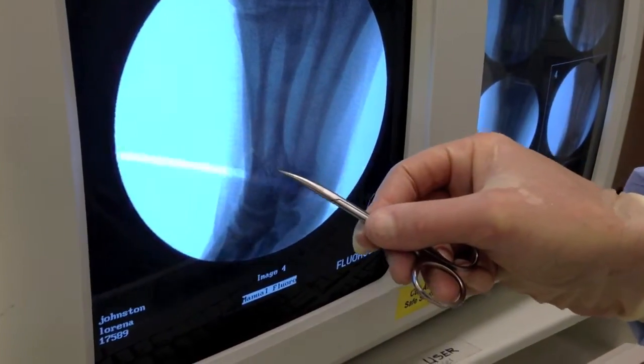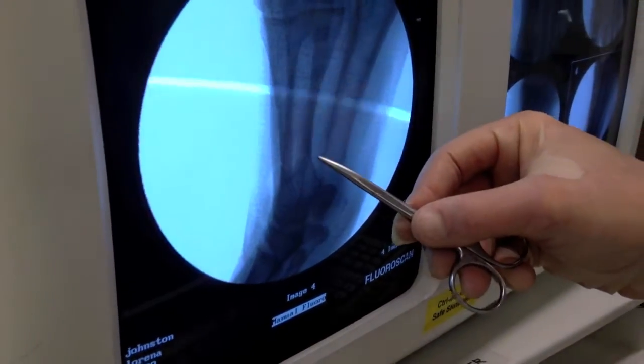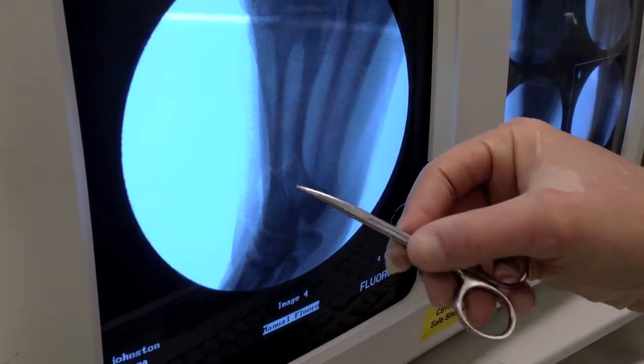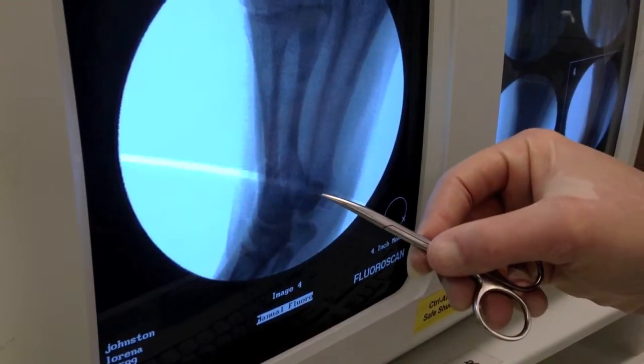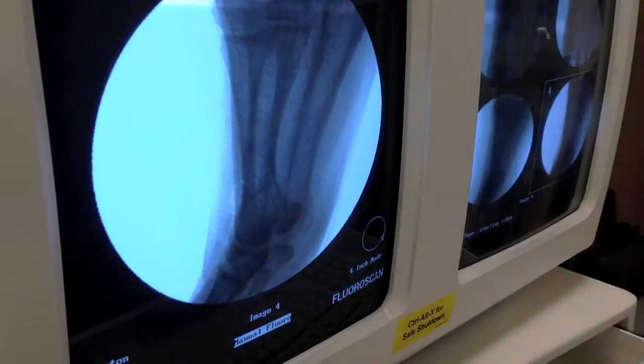X-ray. You can just barely see the V-osteotomy. What's really cool is the shadow of the pin right there is just barely poking out the edge — the length is perfect on these devices. It's flush up here through the osteotomy, and there's no hardware. The patient won't have to have any hardware removed.